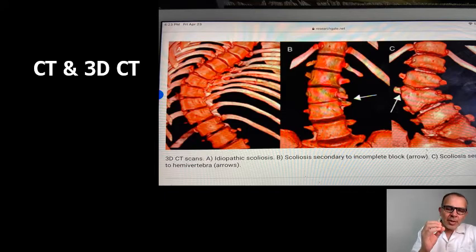No, the bone itself. Any deformity in the bone, as you see here, you can see it as if the patient is open, like you're making an open surgery. So the 3D CT is the best thing to determine bone deformity in certain particular cases, for example congenital kyphosis, congenital non-fusion of the vertebrae, wedge vertebrae, butterfly vertebrae.